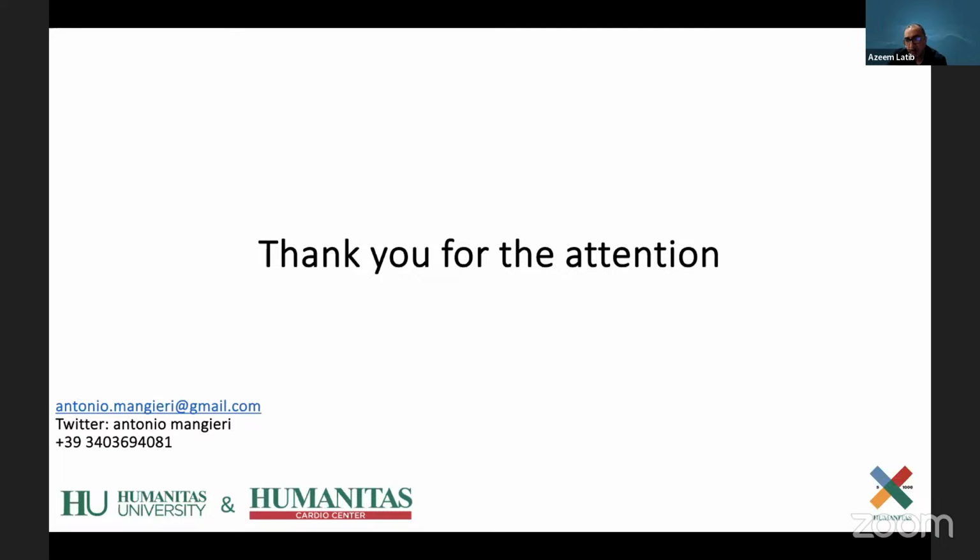So please, please, please don't just say, oh, I want this balloon. Spend some time after the case or before a case. If you think you're going to be using shockwave, if you think you're going to be using cutting, look at the compliance chart, understand what happens with the balloon at different pressures, compare different balloons, hold them together and compare the compliance charts. Just get to understand your devices better. It will make you a better operator.